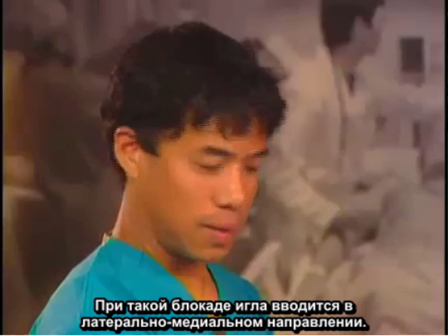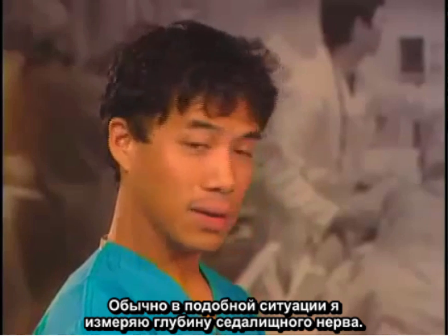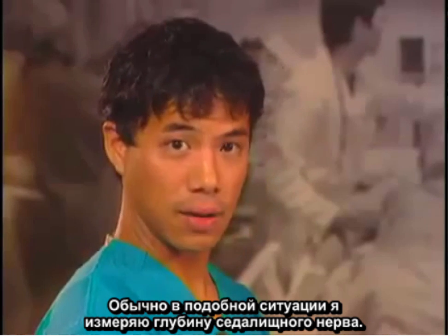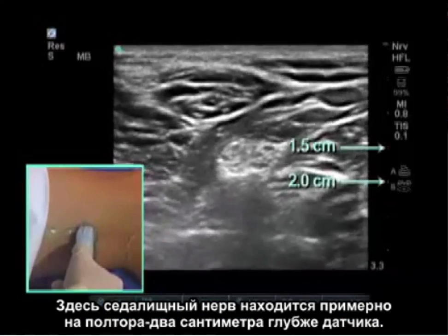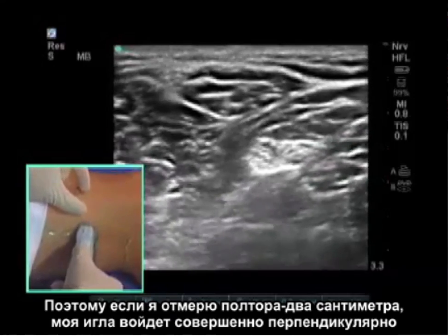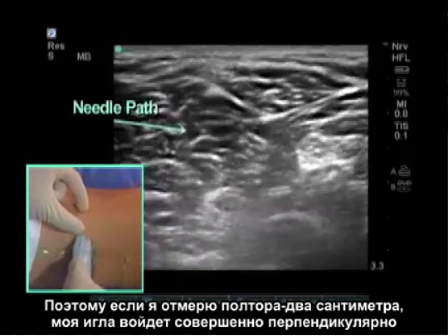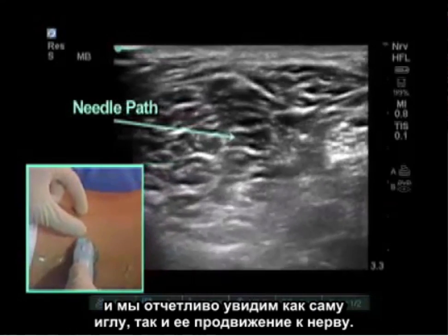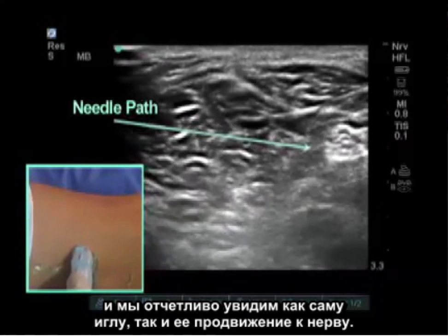My needle approach for these blocks is from lateral to medial. What I typically do is measure the depth of the sciatic nerve — here it is approximately one and a half to two centimeters deep to the probe. Measuring that depth means my needle will come in completely perpendicular, giving a very bright view of the needle and needle shaft as it advances to the nerve.